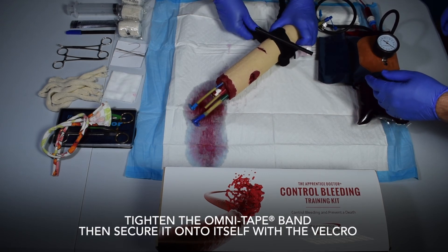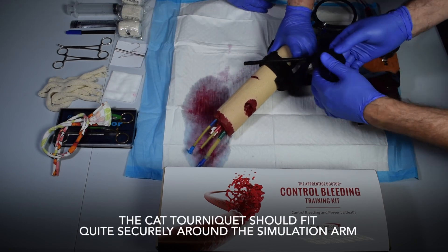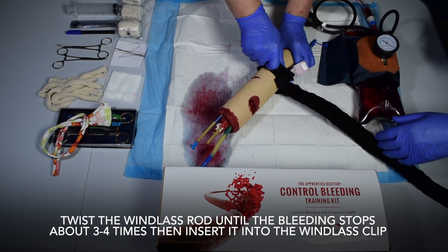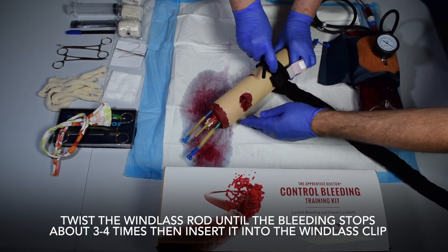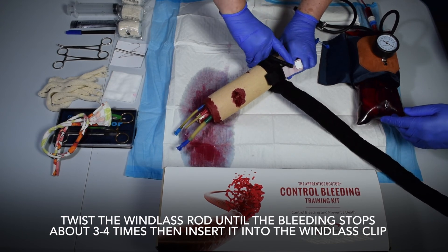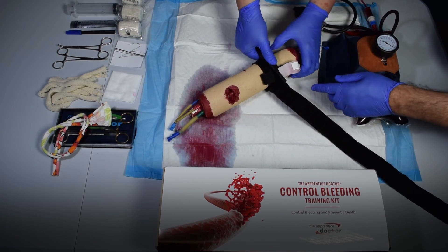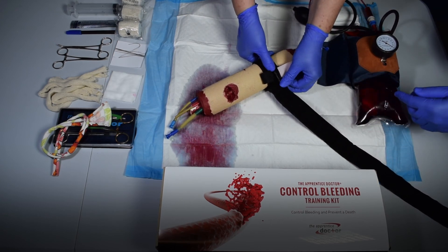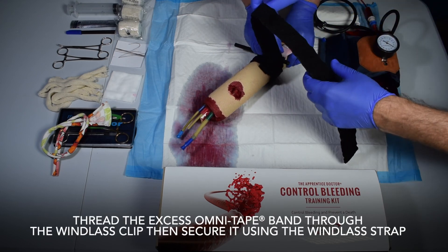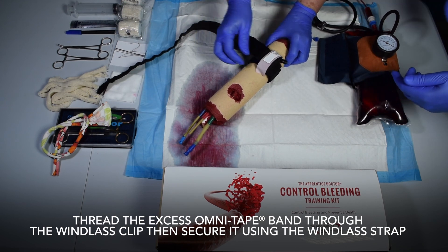Then secure it onto itself with the velcro. The CAT tourniquet should fit quite securely around the simulation arm. Twist the windlass rod until the bleeding stops — about three to four times — then insert it into the windlass clip. Thread the excess omni tape band through the windlass clip, then secure it using the windlass strap.